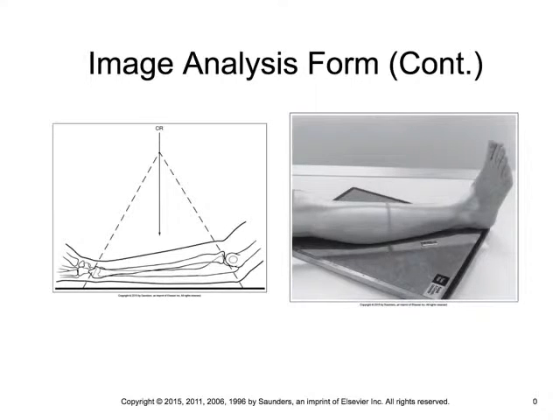What I'm talking about is this. We used to do this on film quite a bit, where we would place the long axis of a bone diagonal to the plane of the image receptor. But this kind of thing will create a histogram analysis in this area that the machine won't know how to recognize. So don't do this. As a general rule, you'll probably see people doing this in the clinical sites because they do not understand how histogram analysis works. They're probably techs who did the boards prior to the rollout of all this DR, CR kind of considerations, and they're not aware of the impacts of this on the post-processing for the computer.